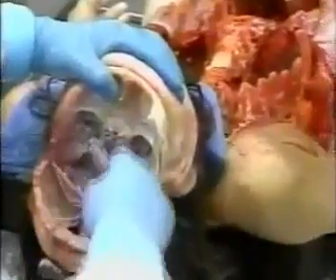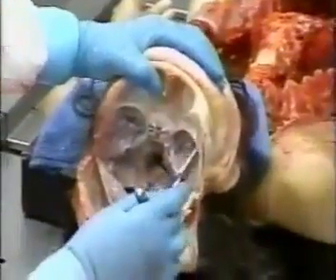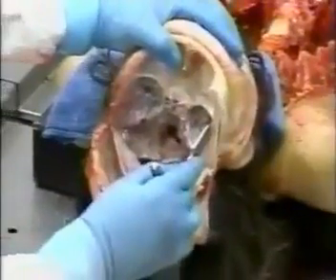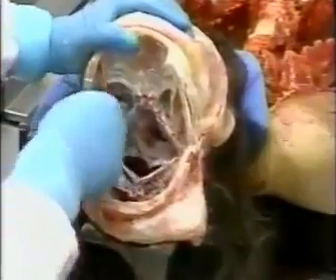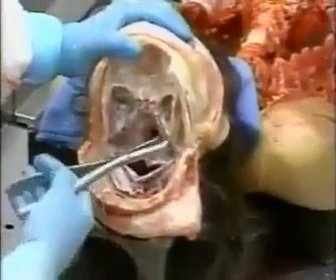The skull on the inside is lined by a tough membrane, the dura mater. In order for us to be able to visualize if there's any fractures, that membrane needs to be peeled away from the underlying bone. So that's what the assistant is doing here.